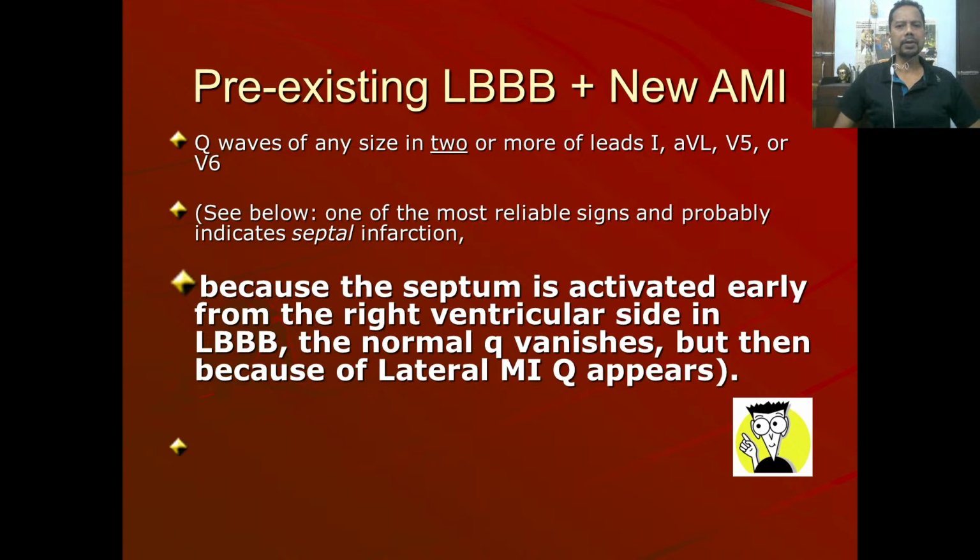So how will you diagnose acute MI in the LBBB setting? These are a few points you should remember. You can come back and see these slides again and make notes, and if you make notes, you think you have mastered Leo Schamroth and Goldman and Marriott and ECG Made Easy, and so this is cool stuff.